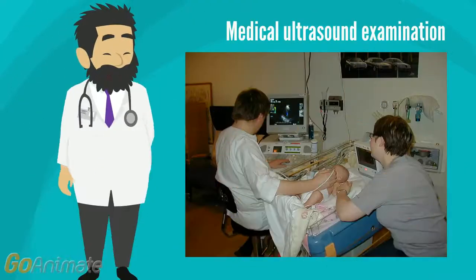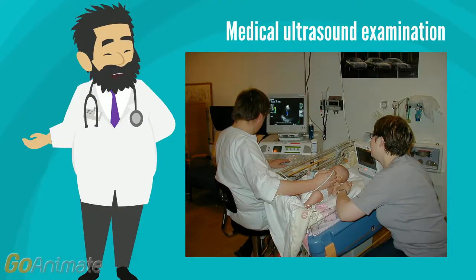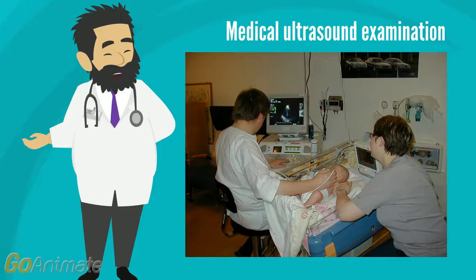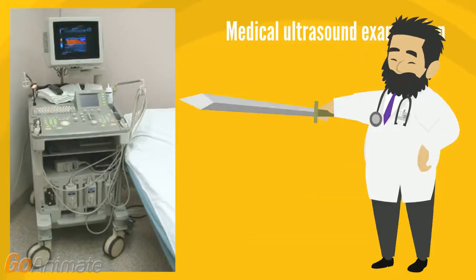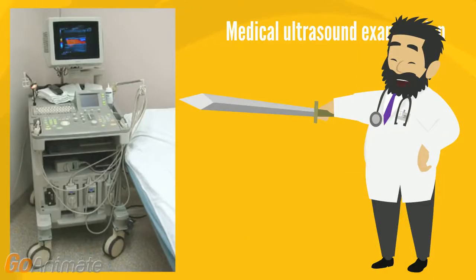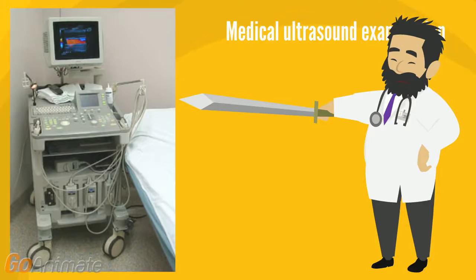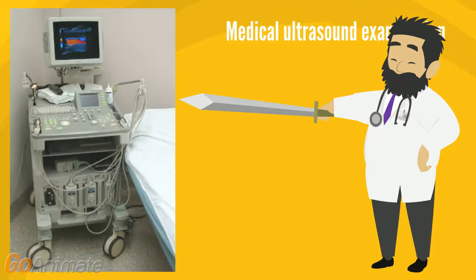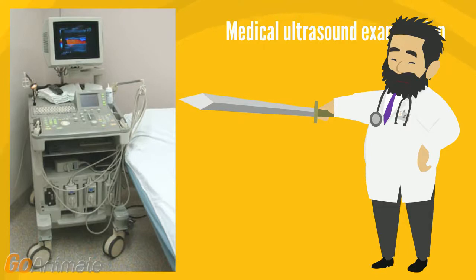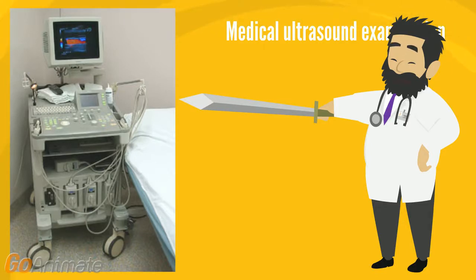This video presentation shows the advantages of medical ultrasound examinations in diagnosing abdominal diseases. Ultrasound is an extremely useful tool in diagnosing many types of medical conditions. It can be done in almost any location, and it is safe and non-invasive, requiring no use of radiation.